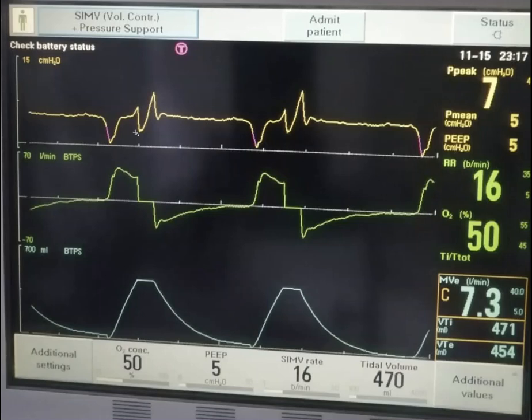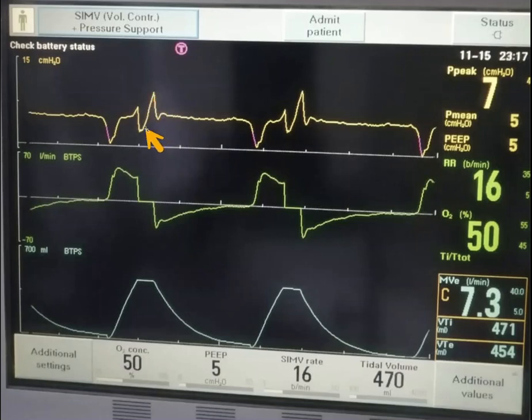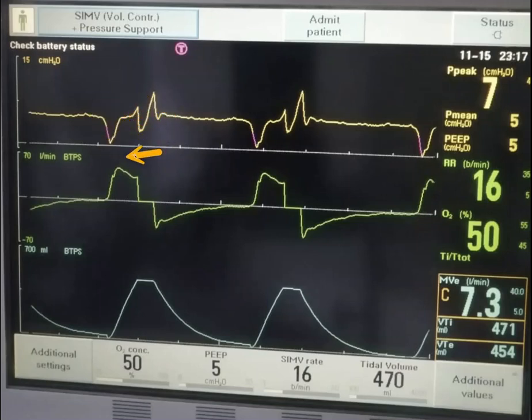At this point, it looks like his intrathoracic pressure decreased a little bit, and then the machine gave extra pressure. Then he inhaled again at a deeper level, and the machine's pressure went down again. At this point here, this is plateau — you can see zero flow and we're already done with the tidal volume. We need pressure to keep that tidal volume inside the lungs, and the patient is not making that pressure, so that's why the machine's pressure went up. Once exhalation started, the pressure is released. That explains the variation in pressure within the breath due to variable inspiratory efforts of the patient.